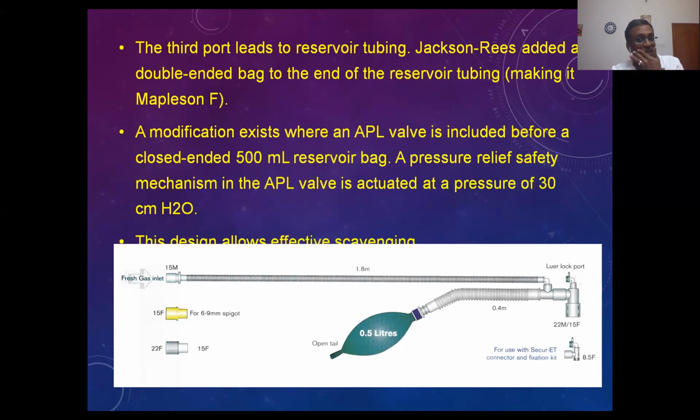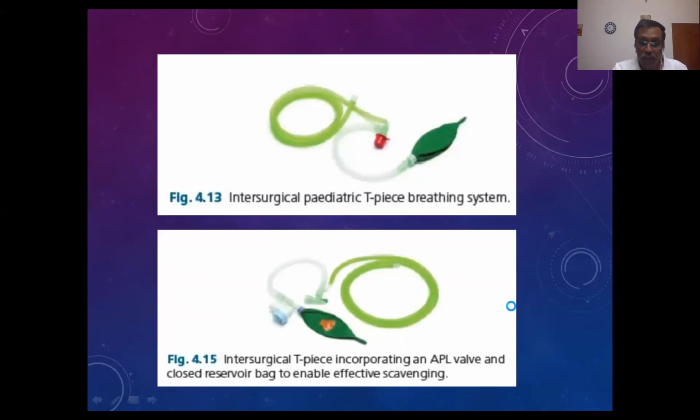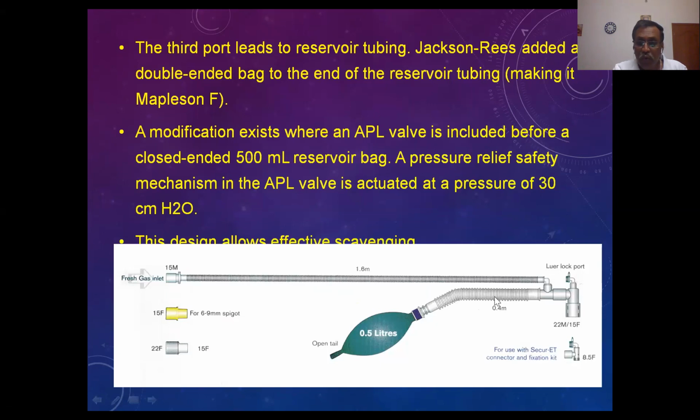The Venturi effect, I have already told, I have taken a class regarding this principle during my physics class. And this Venturi effect will suck air from the atmosphere, and the pressure in the circuit will become very low, and the kinetic energy will become very large, and entrain more air from the atmosphere to the patient, and that will lead on to so many problems.